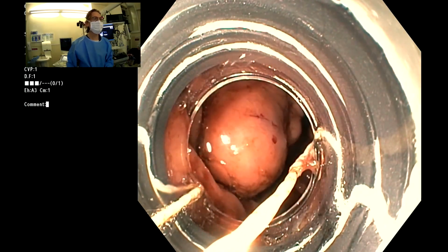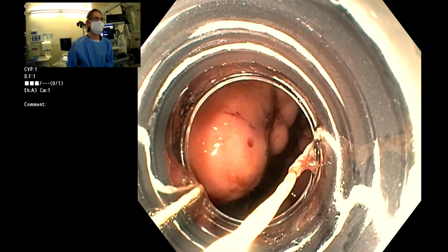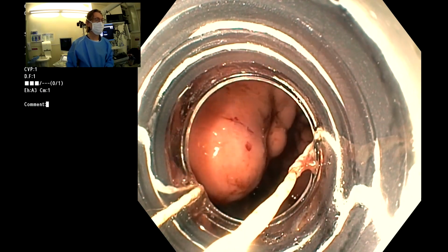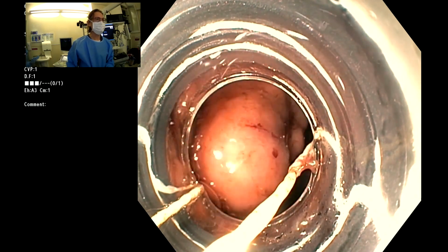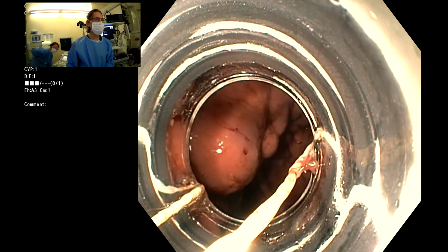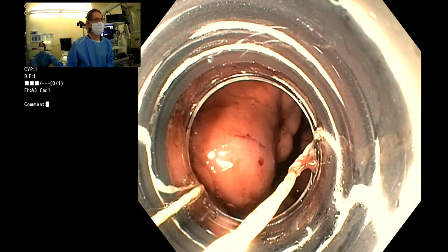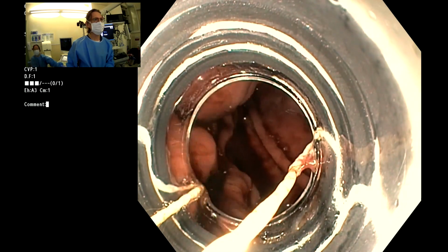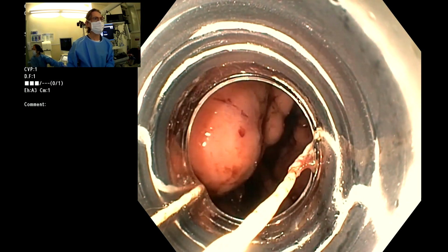So we're going to band ligate the esophageal varices, but I'll take this opportunity to just take a quick look at the fundus after treatment with coil and glue. You can see the fundal varices now. They always look more prominent after the glue procedure because the glue expands, also creates a very intense exothermic reaction. Some patients actually have fever after the procedure due to that. That's the formaldehyde that's generated from the glue.